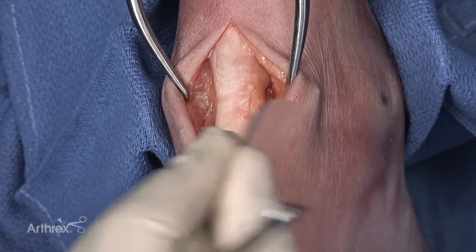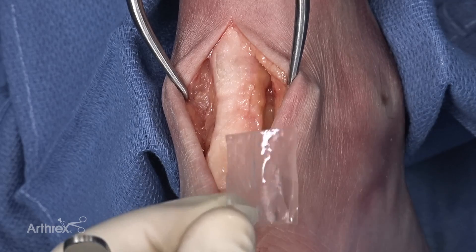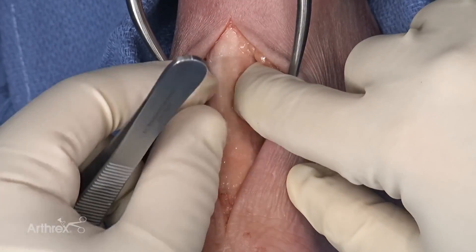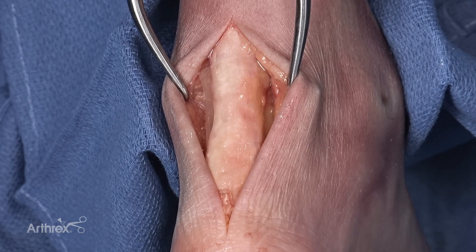Centiflex does not have any side bias to it — it can be placed with either side down. Centiflex is simply hydrated by dipping it into saline for a few seconds, and you get a product that's ready for use. You can see Centiflex will contour the surface of the Achilles tendon very well. In this particular instance, we're going to utilize an absorbable suture for temporary fixation in the superior medial and superior lateral corners of the scaffold to give the surgeon freedom to utilize both hands during the repair.